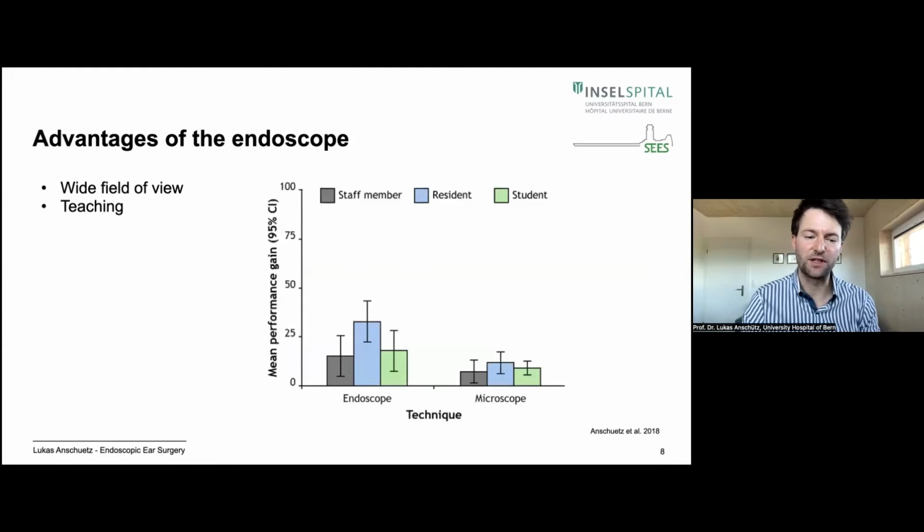Also, as was already mentioned in the introduction, teaching with the endoscope is facilitated because the teacher and the trainee really have the same view during their activity. And we compare here the performance gain of some staff members, residents, and medical students during an anatomy training program. And we can see with the endoscope, the gain in knowledge was much higher compared to the microscope. And this is especially true for the residents.